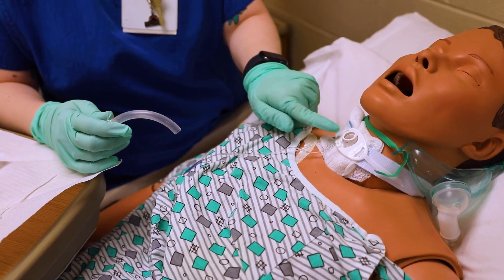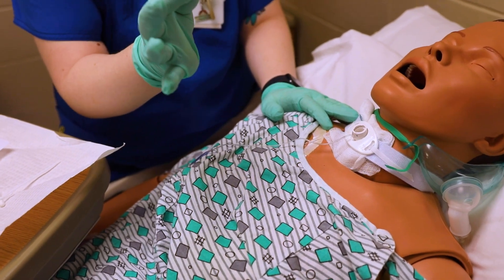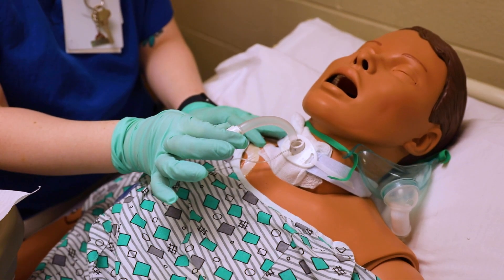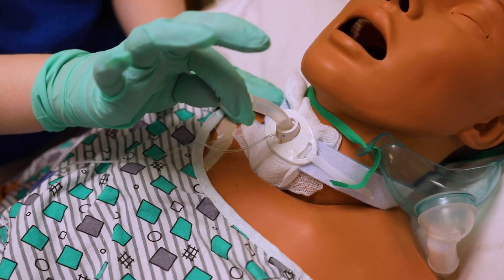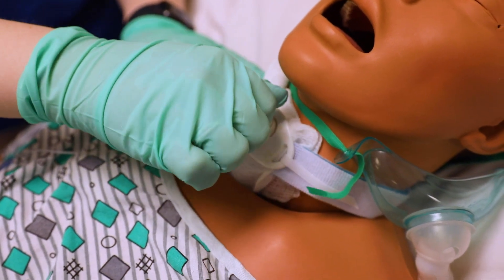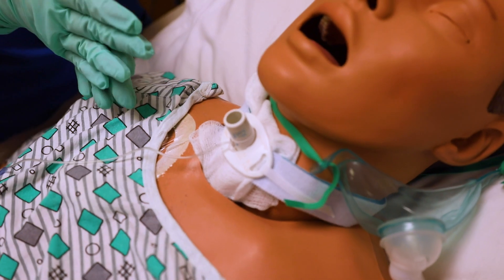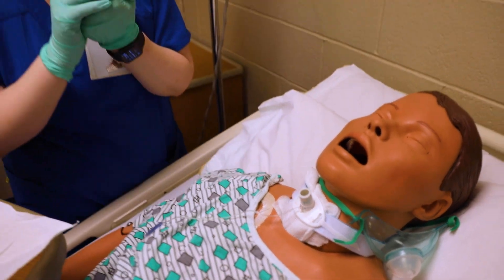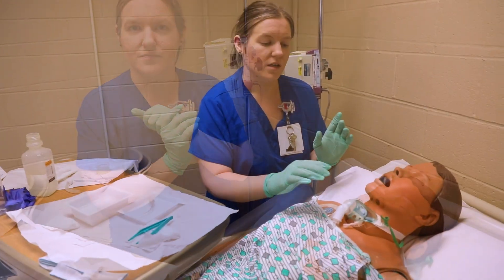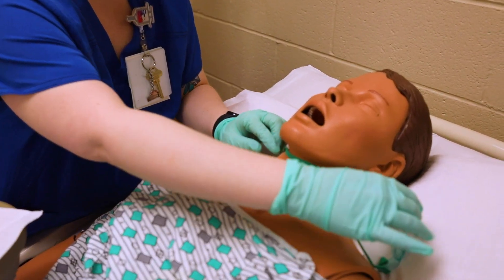After you've cleaned your entire tracheostomy, you may have to suction inside the little hole to get some secretions out. Then you're going to take the sterile inner cannula and insert it just like this. This one in particular you twist to lock — do whatever that specific trach requires. Now you're ready to go ahead and do the dressing change, so I'll take the oxygen off the patient after hyperoxygenating again.